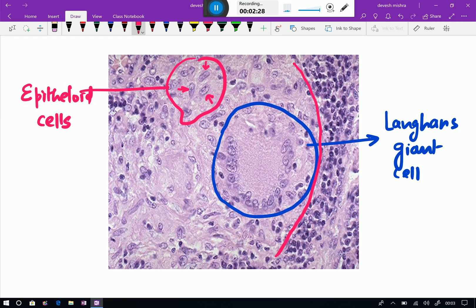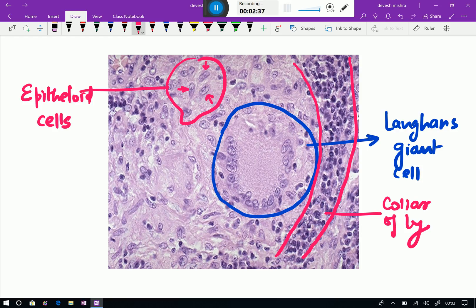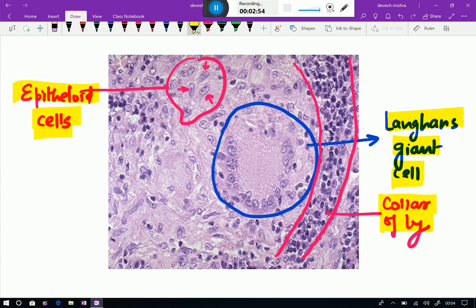Again, when you look at this area, there is a small mononuclear lymphocytic infiltrate — these are collar of lymphocytes. So you can see this is the perfect definition of the granuloma: we can notice epithelioid cells, then surrounded by collar of lymphocytes, then accompanied by giant cells. This is the perfect description of any granuloma.